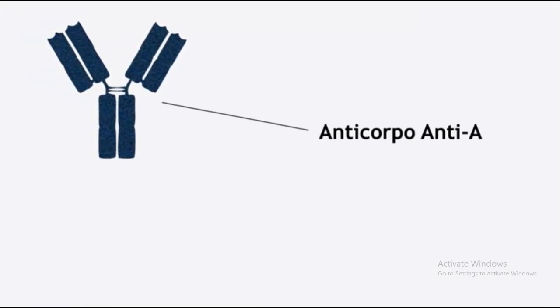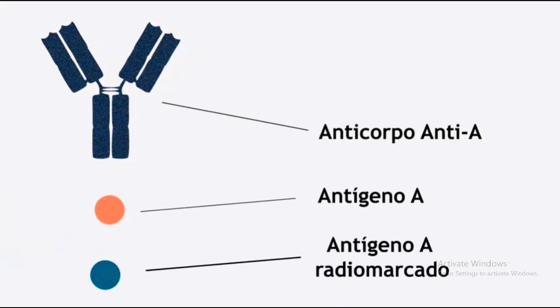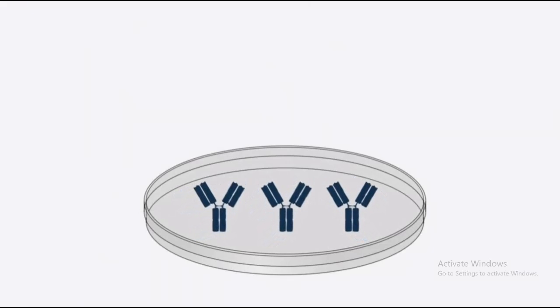Okay, folks, this is a radioimmunoassay. In this scenario, we have an antibody directed against a target, say for instance it's insulin. The red indicator is insulin that would be present in serum, and the blue marker is radioactively labeled insulin that's provided by the company. The way this concept works is you put the antibody directed against the insulin onto a plate. You then add the radio labeled insulin provided by the company to the antibody, and you get binding. So all the antibodies have radioactively labeled insulin bound to them.